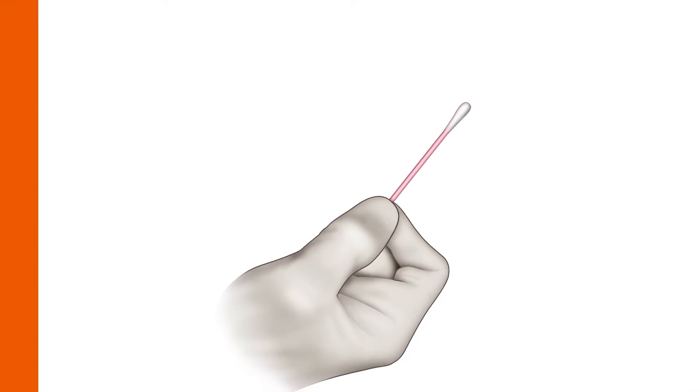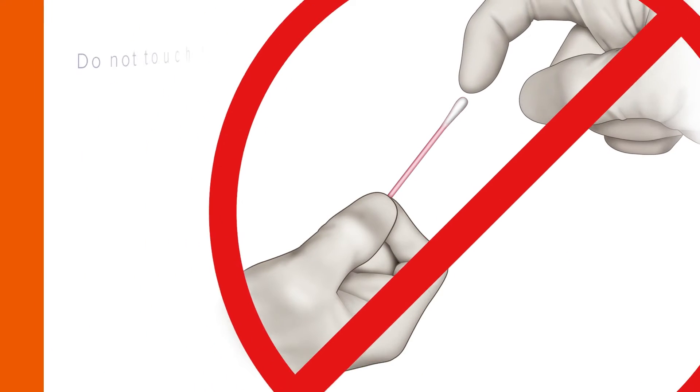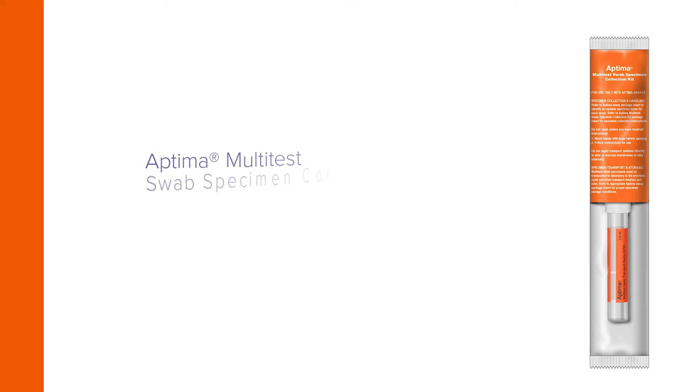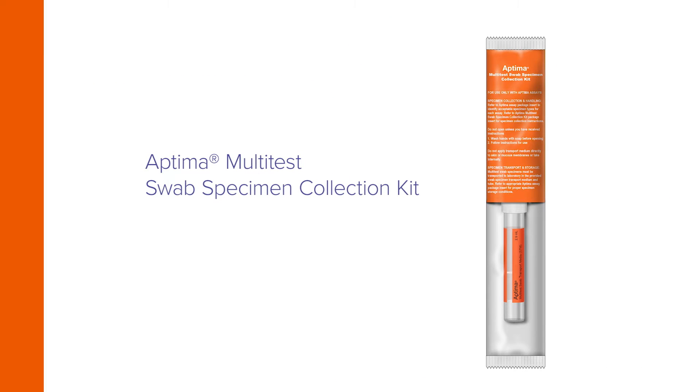Begin by removing the swab from its package. Do not touch the soft tip or lay the swab on a surface. If the soft tip is touched, laid down, or dropped, discard it and get a new Aptima Multitest Swab specimen collection kit.